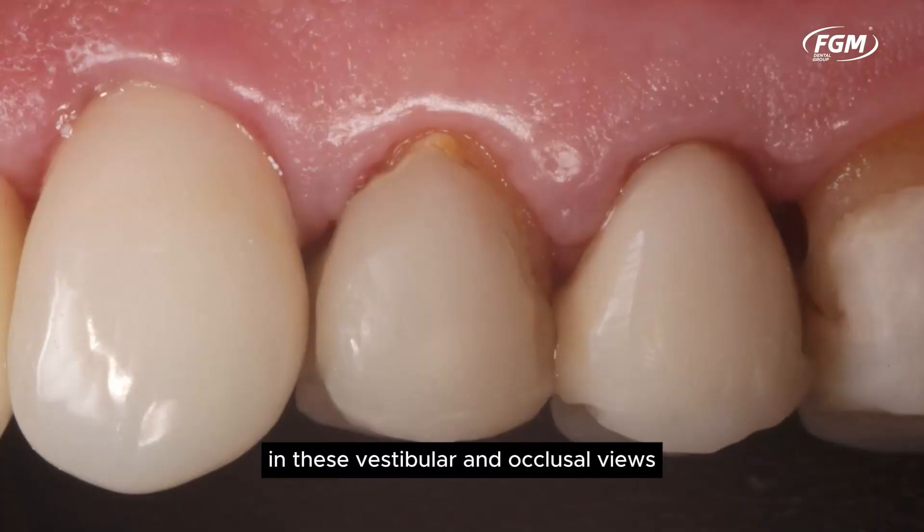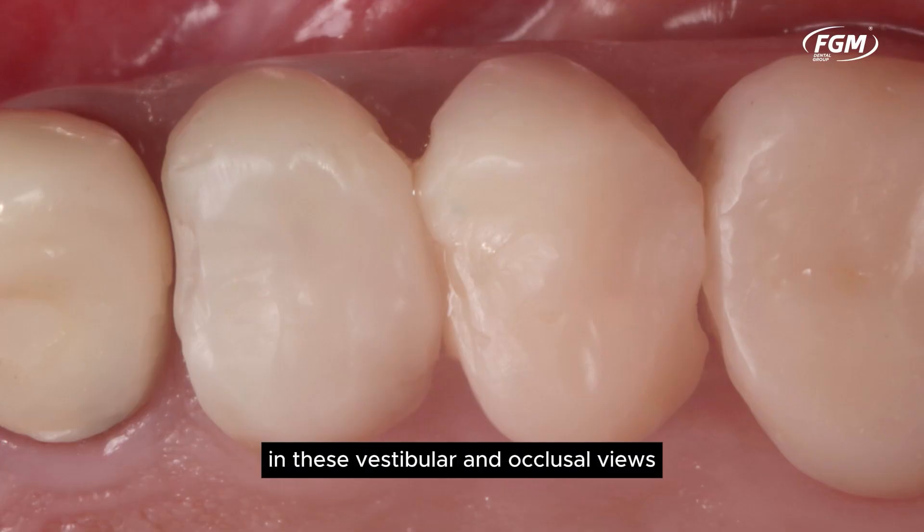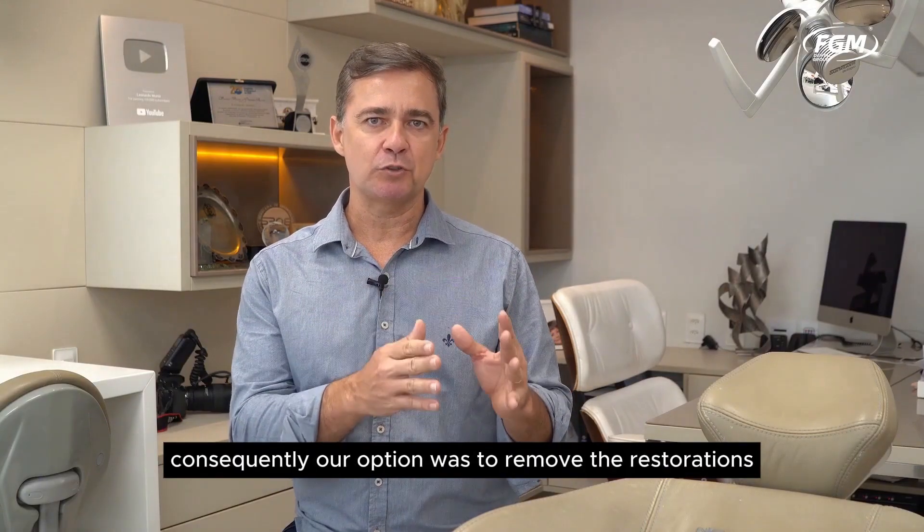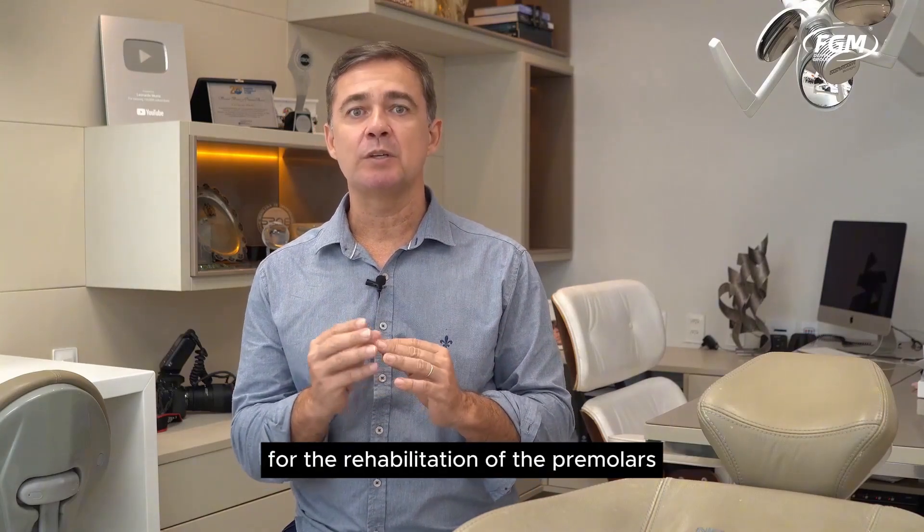Initially, observe in these vestibular and occlusal views the presence of unsatisfactory composite resin restorations in Units 24 and 25. Consequently, our option was to remove the restorations for the rehabilitation of the premolars.